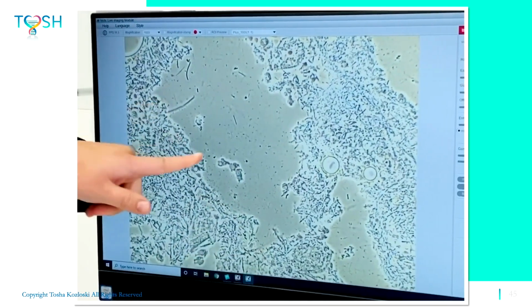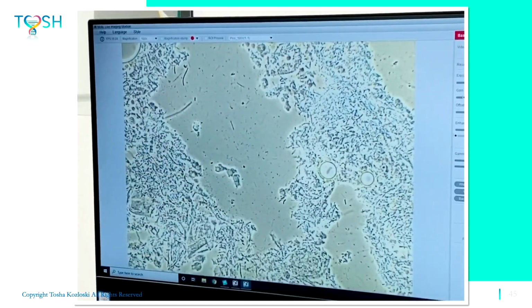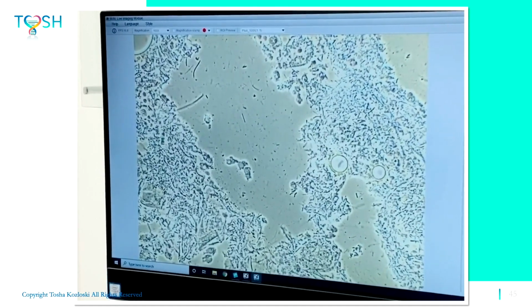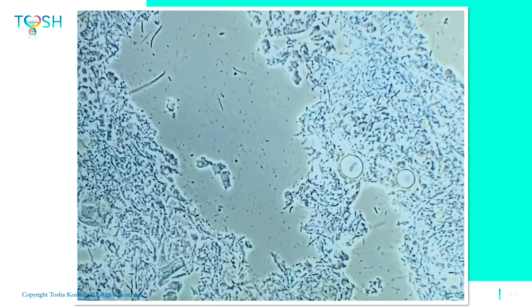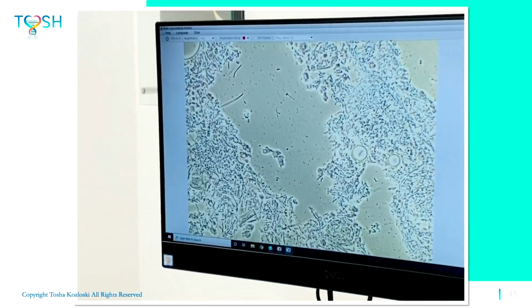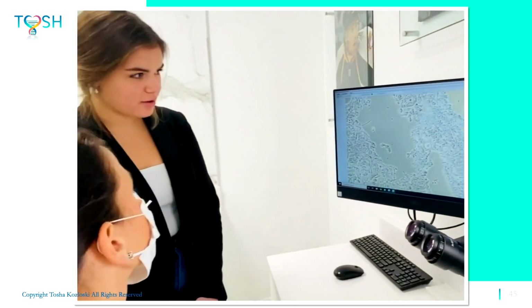And those are like spirochetes, right? Yep, all those little snaky things are spirochetes. So definitely some infection that we need to use medicine to treat, because what we need to do now is to help your body decrease that overall pathogen load so that your immune system can take back over and get you back healthy. Okay.